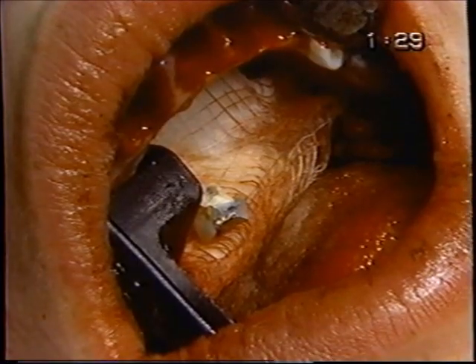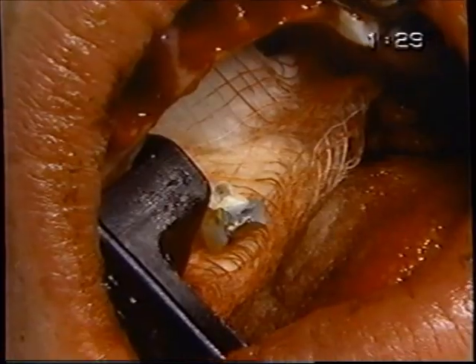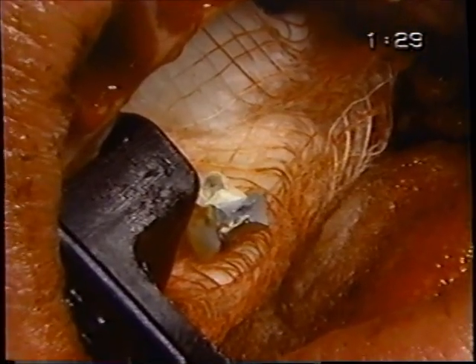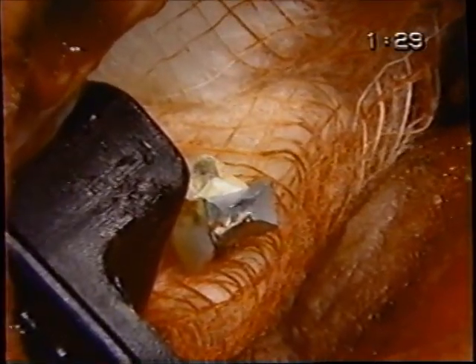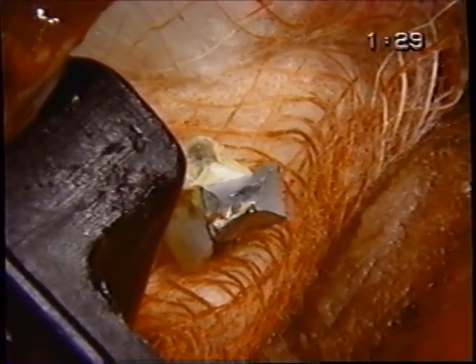Okay, we just noticed that there's a piece of tooth from one of these anteriors that had fallen back and is on that piece of gauze throat pack. That's the main reason that we use that. We try to always use it. Oh, did you see that? Squeezed on the tooth and infection came out of the nerve chamber.